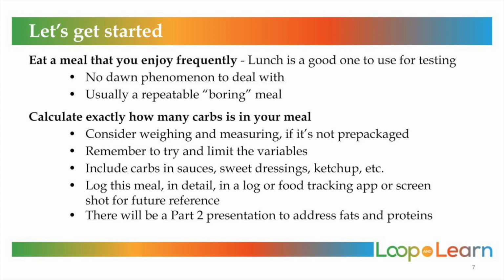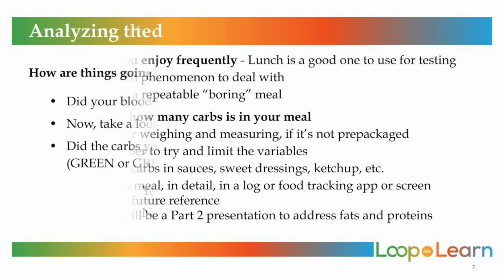Using one of the food apps like MyFitnessPal we mentioned before can really be helpful, especially when we get into our next presentations where we will talk more about fat and protein. Recording a few meals from time to time is an easy way to double-check your guesstimates and look for inconsistencies in your carb counting. Knowing precisely what you're eating will help you to fine-tune your Loop settings. Now enter your meal into Loop and eat.